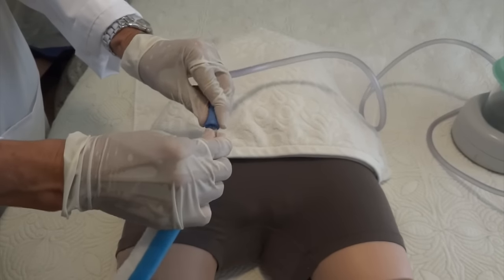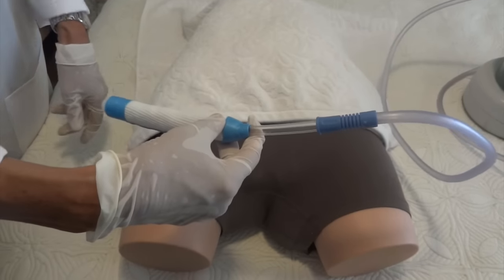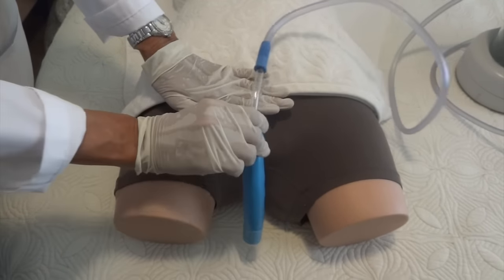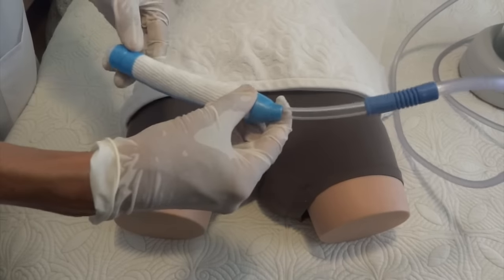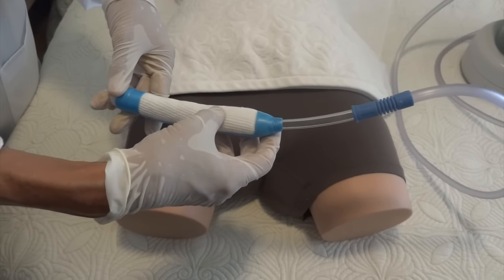Connect the wick to the tubing. When placing the wick, you want to have your thumb at the level of the top part of the wick, and then the thumb goes to the level of the pubic bone. You want the urethra to be around the top third of the wick.